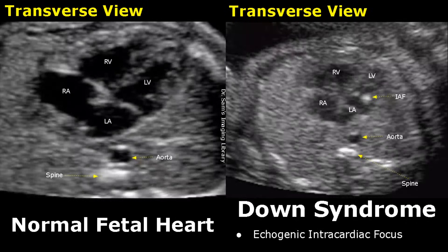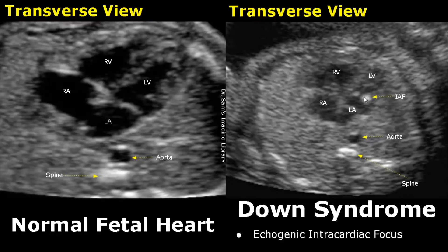Echogenic intracardiac focus is a hyperechoic structure seen within the fetal heart. It looks like a hyperechoic dot. In the normal image, no such hyperechoic structure is seen within the heart. This can be seen in a fetus with Down syndrome.